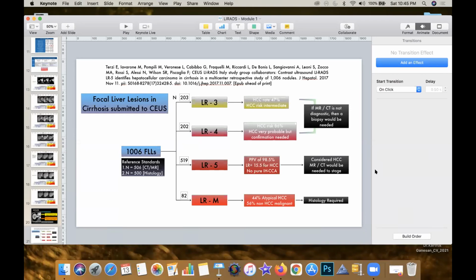If you go to dysplastic observations, they typically would be T1 bright. They would generally be larger than the surrounding observations. So typically in micronodular cirrhosis, the observations are between 2 and 10 millimeters. Dysplastic nodules tend to be on the larger side. The T2 signal is going to be lower, but they may show arterial enhancement with or without some degree of washout. So enhancement, T2 signal, and the T1 signal, you can differentiate the three entities.